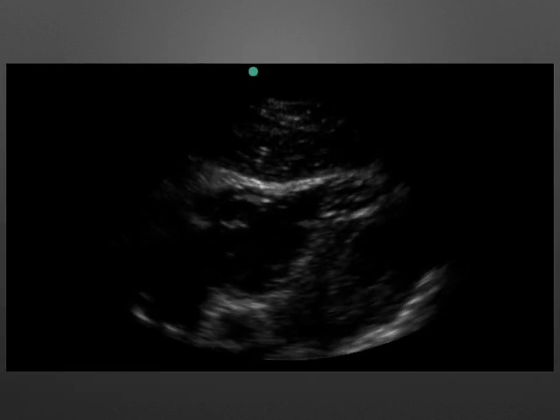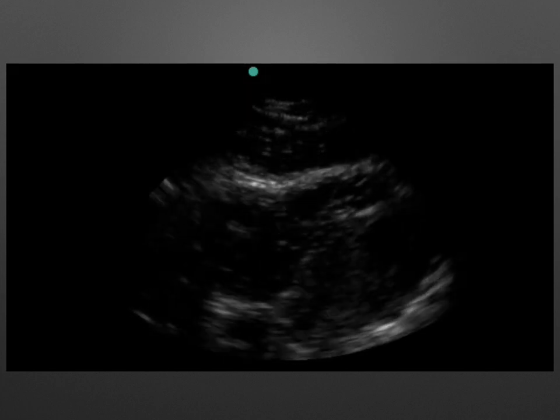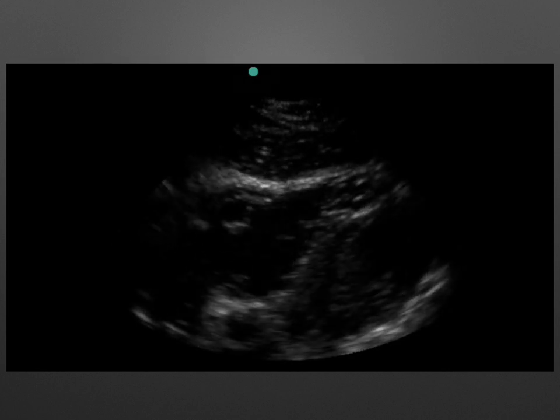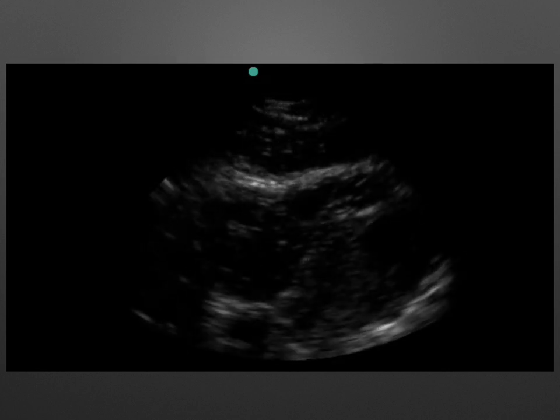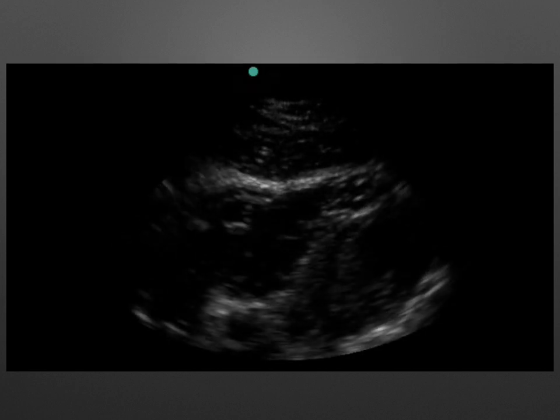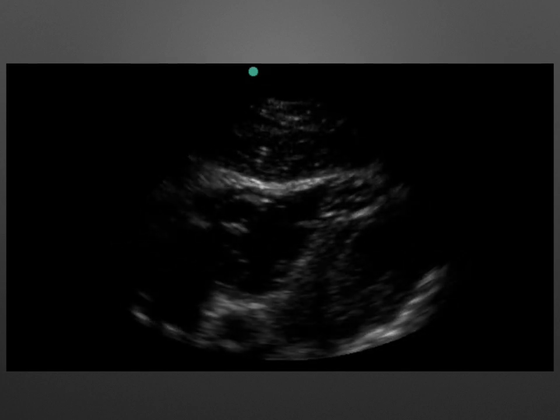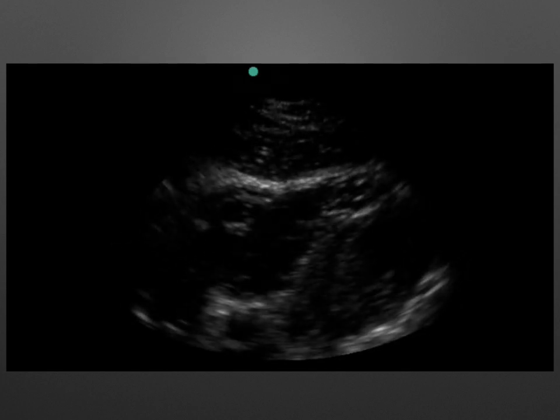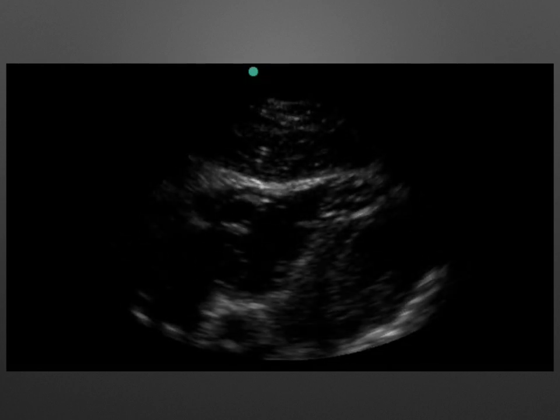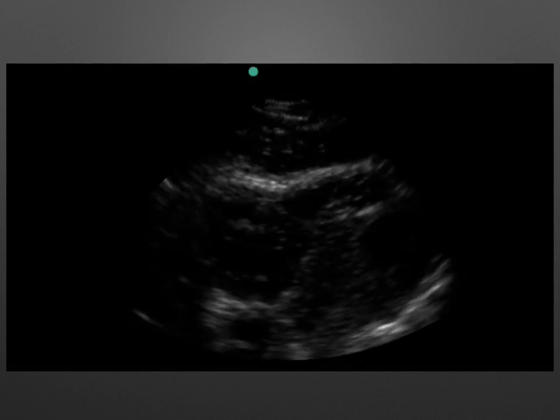This is a patient who had an echo with asystole, and what you can see here is that the heart is not contracting, but we still see some fluid moving through the heart. So what is that? That's actually the IV fluids being pushed through the chamber. And I put this up here just so that we don't get confused with this and some sort of function.